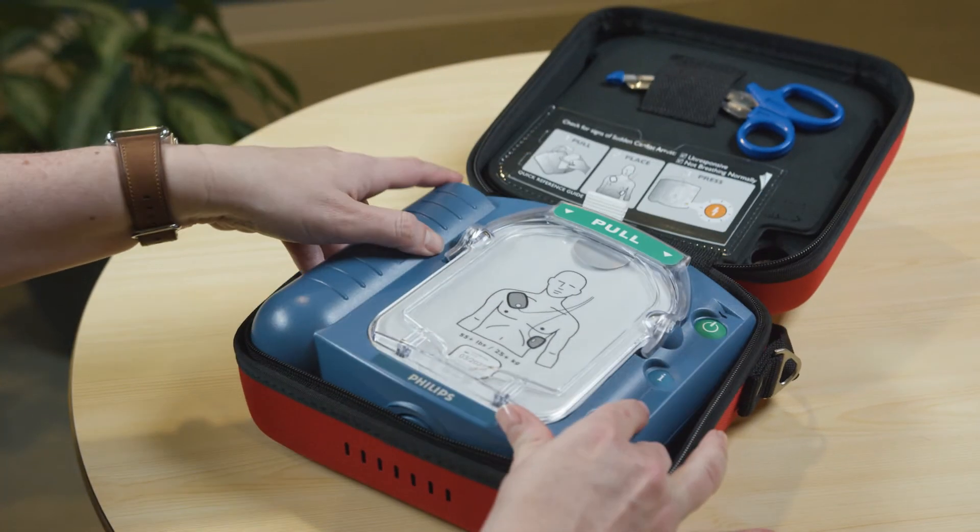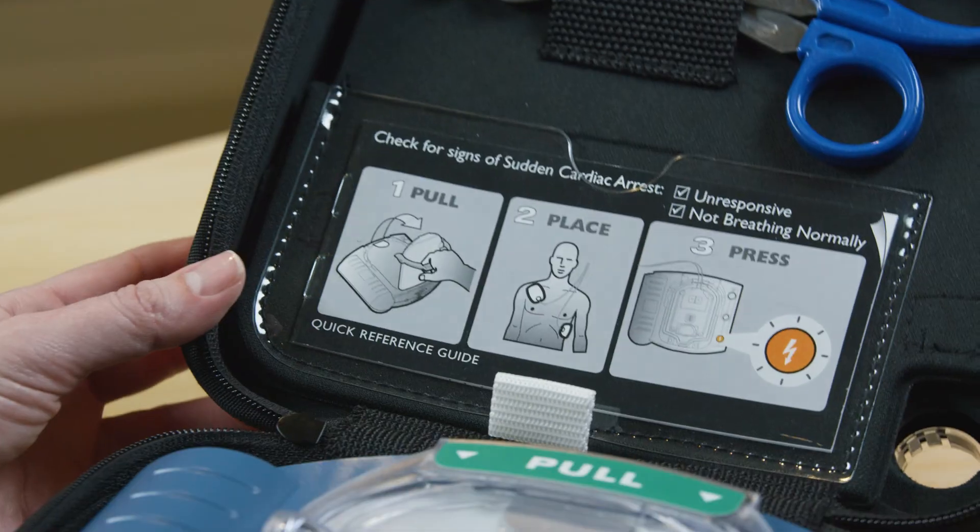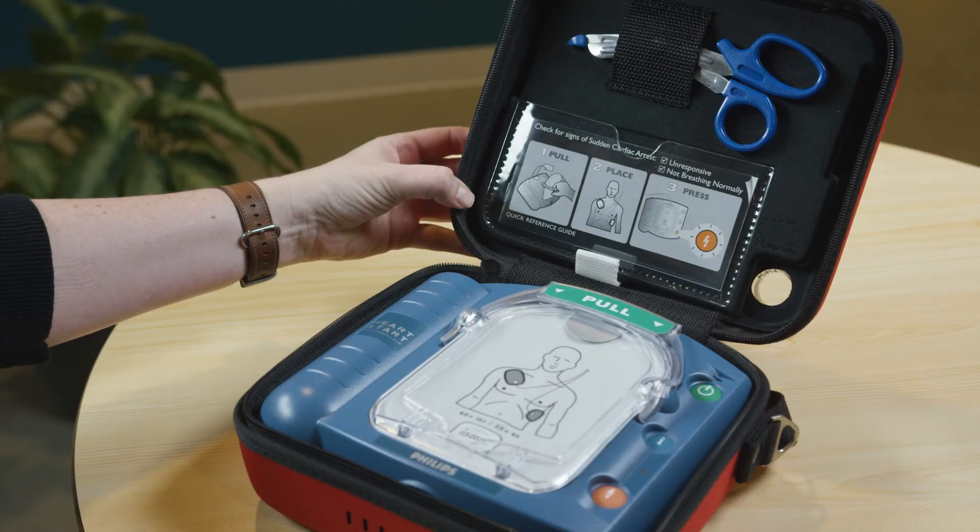To store your HeartStart, put the device back into the case. Make sure the quick reference guide is clearly visible in the space provided.